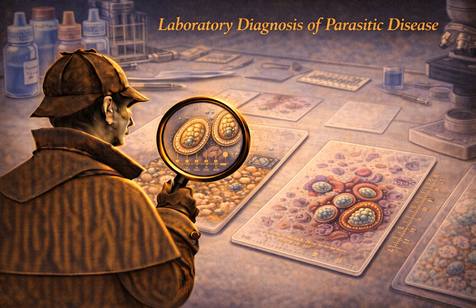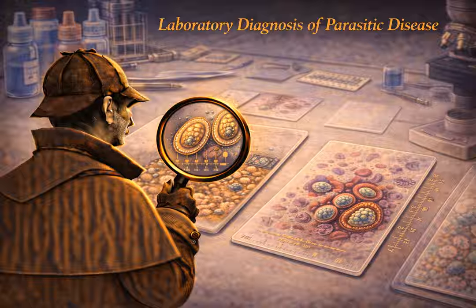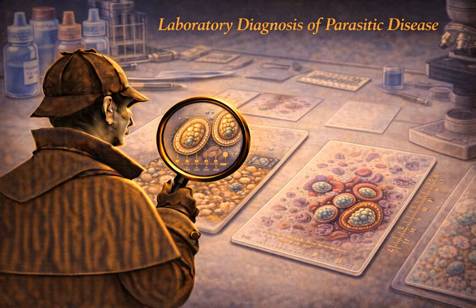That is strangely poetic for an organism that causes explosive, foul-smelling diarrhea. Biology has its weird beauty, even in the bowel. And then on the permanent trichrome stain, the Giardia trophozoite is distinctly pear-shaped. It has two prominent nuclei that look exactly like eyes, and a central axostyle running down the middle that looks like a nose. It literally looks like a little clown face, or an old man with glasses staring right back up at you through the microscope. Once you see it, you will never, ever forget it.